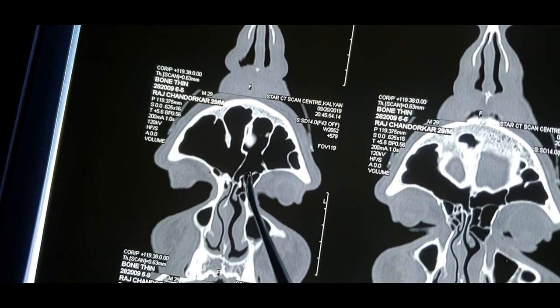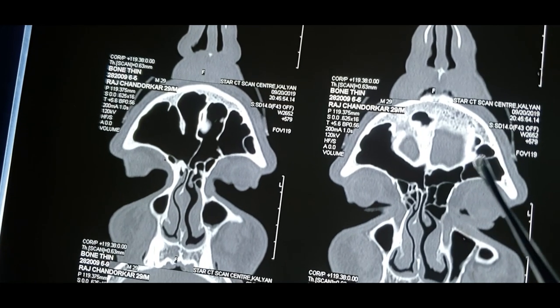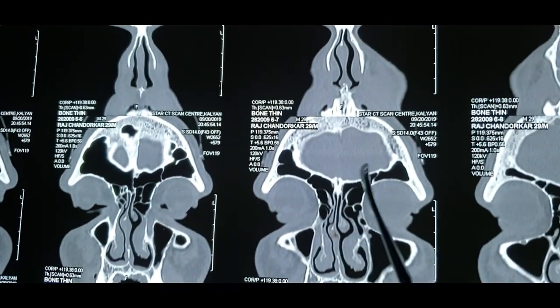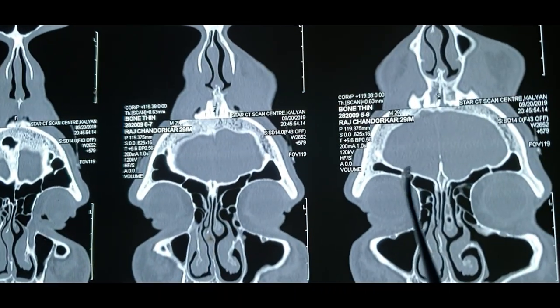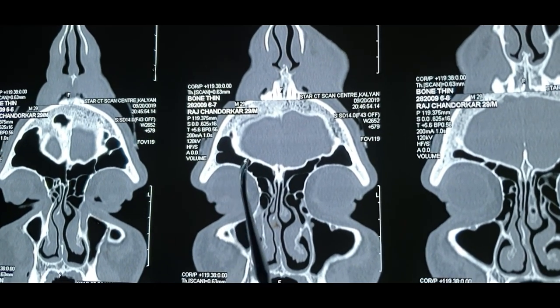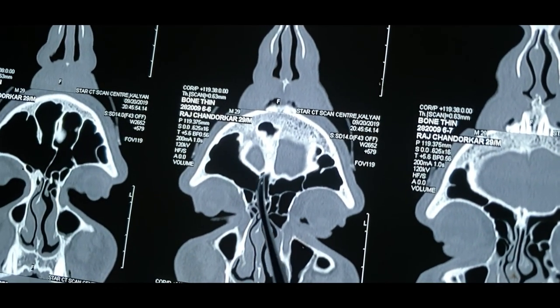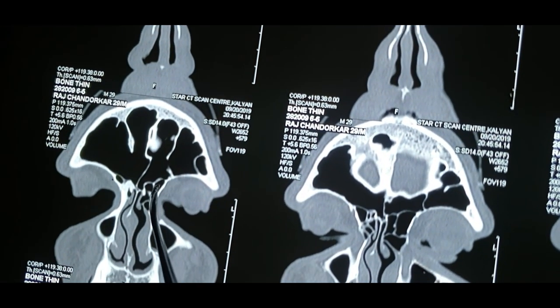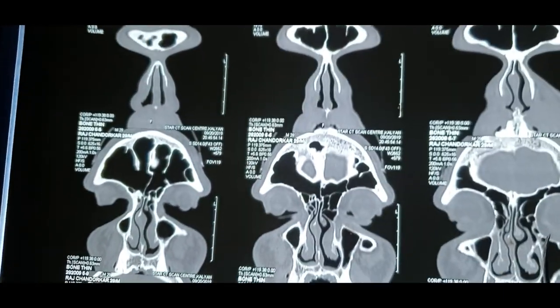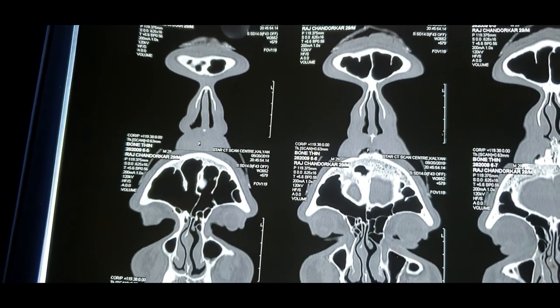And once the frontal recess starts, if you still see an area similar in appearance to a frontal sinus, it is not the frontal sinus but the supraorbital cell. It is shaped like a frontal sinus and can mimic it and confuse you, but it is not a frontal sinus, it is a supraorbital cell. So this was the frontal recess area. On the sagittal scan, this is where the sagittal scan is very important to know the anatomy in detail for the frontal recess anatomy.